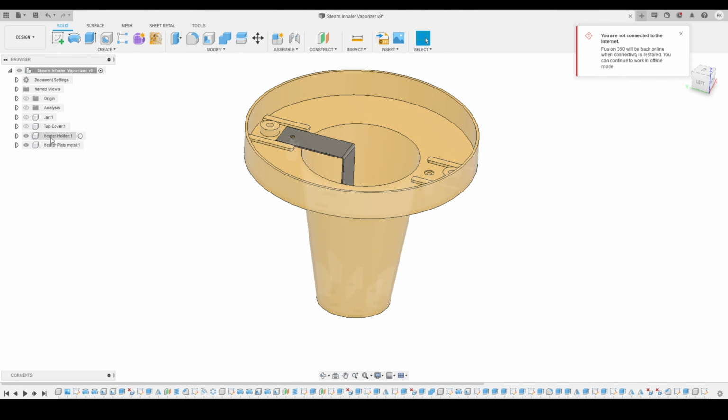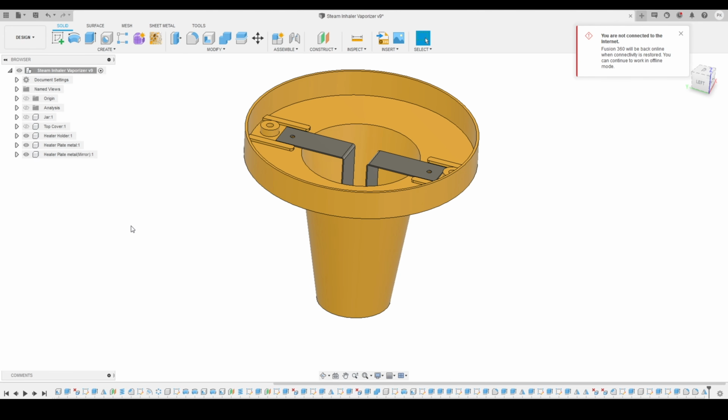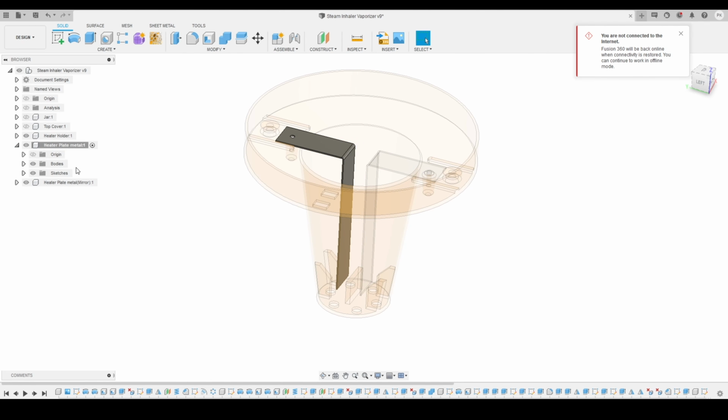Now I will select this particular component, activate the mirror tool, select the mirror plane and press OK. So the same component got mirrored on the other side. To mirror the particular component, you have to turn on the top level assembly first. Here you can see. Now if I turn on the other components also, you will be able to see that particular component in the highlighted view. Here you can see that.